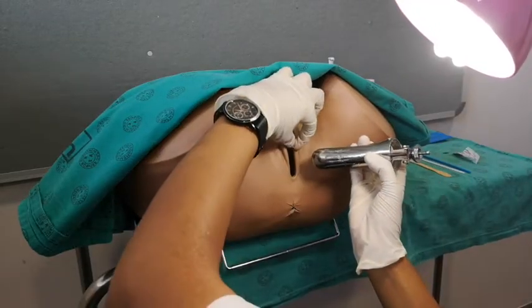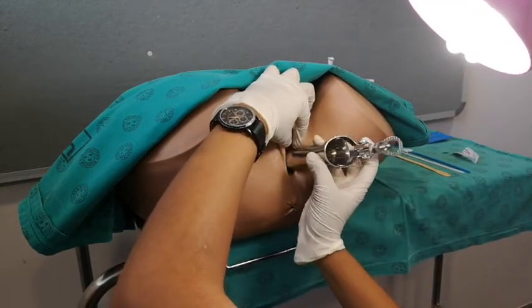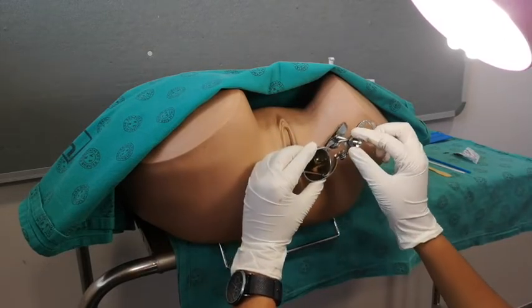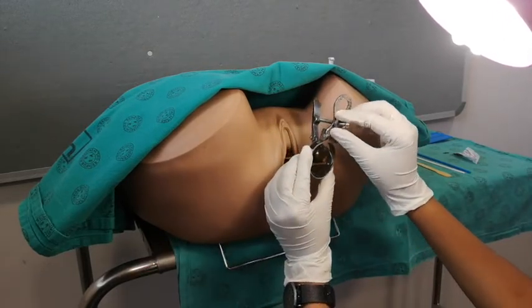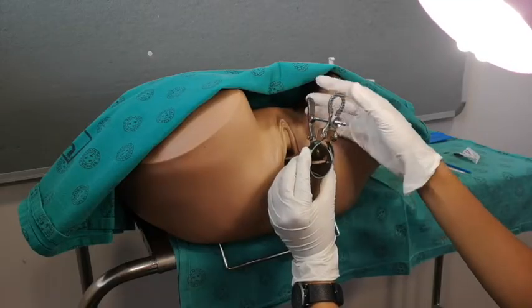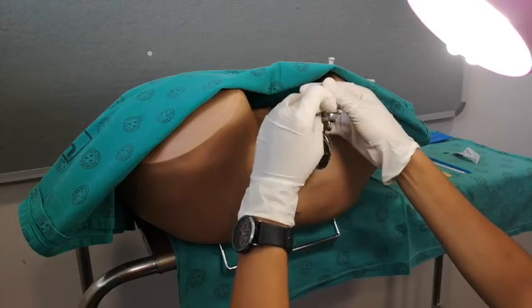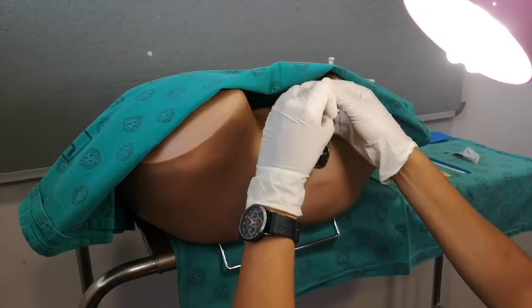Insert your speculum by parting the labia with your non-dominant hand and advance the speculum in a downward and forward fashion. Once you've visualized the cervix, you can lock the ratchet.